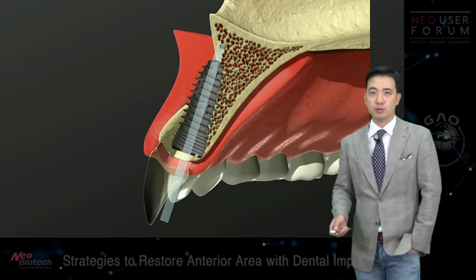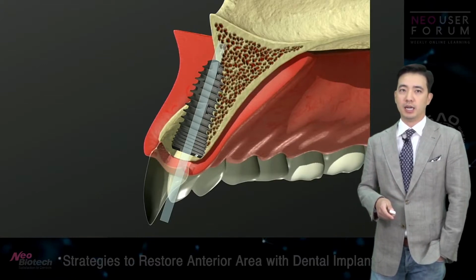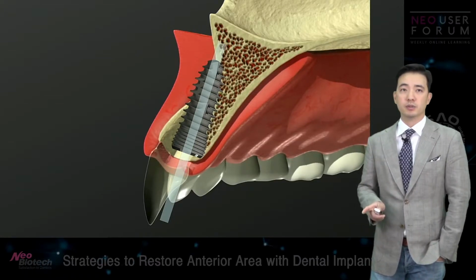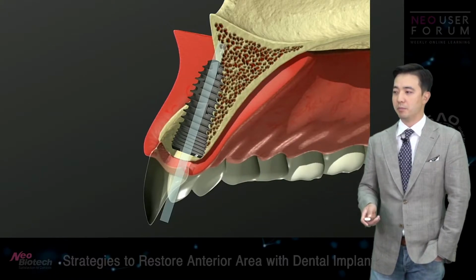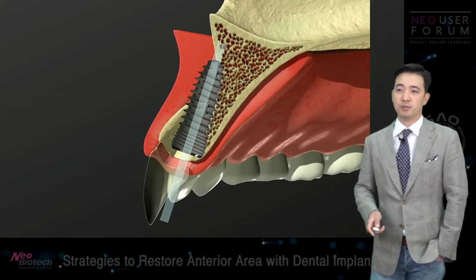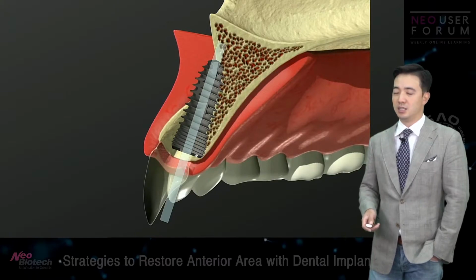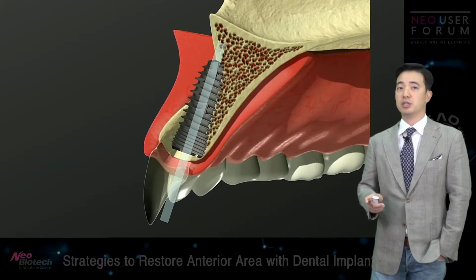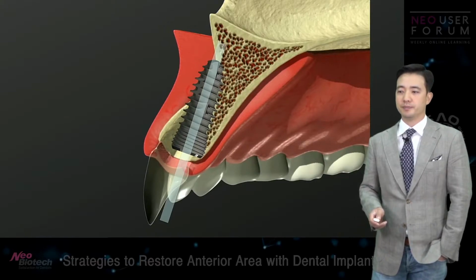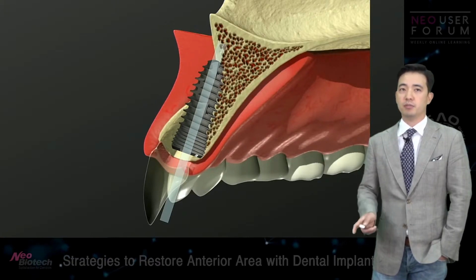So what I want to do personally is that I would still go for this kind of position, because your implant is going to last in your patient's mouth for decades, and just because it's easier to place your implant according to where the patient's bone is, doesn't mean that whatever prosthesis you put in the patient's mouth is favorable for the patient.